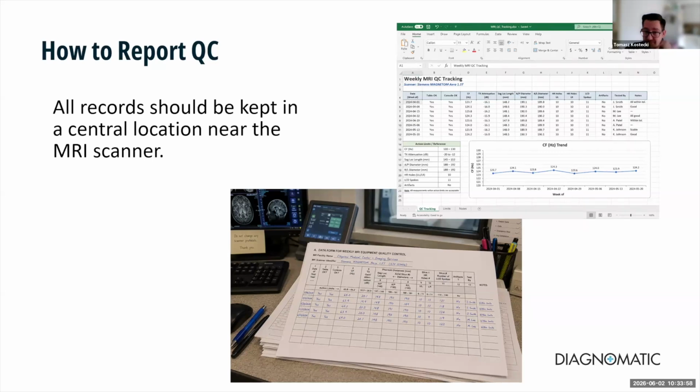For example, at my first MRI site, out of boredom, I started making my own Excel charts to track helium levels over time. When I looked at the trend, I noticed that something was changing. It was a possible helium leak, and in the end, that's exactly what it was. The timing was also important because it was close to the end of the year, when getting a helium refill can be much more difficult. That simple chart may have helped the hospital to avoid a quench, and at the very least, it probably saved a service engineer from spending Christmas at work.